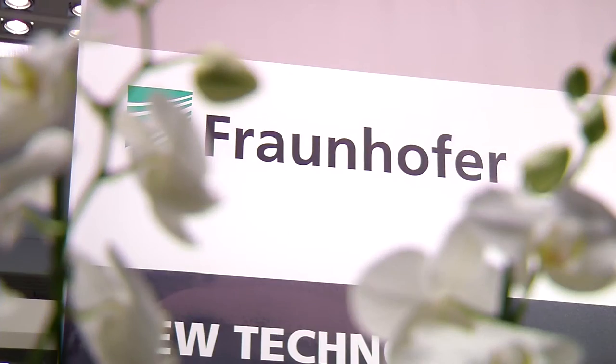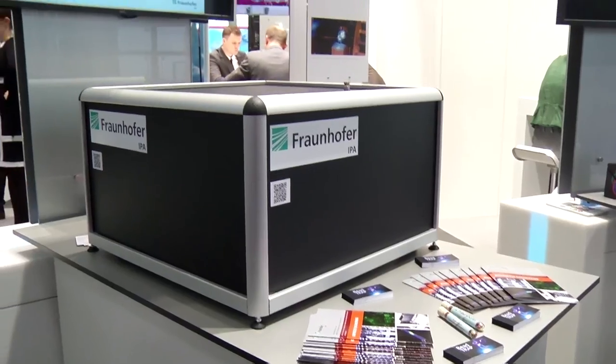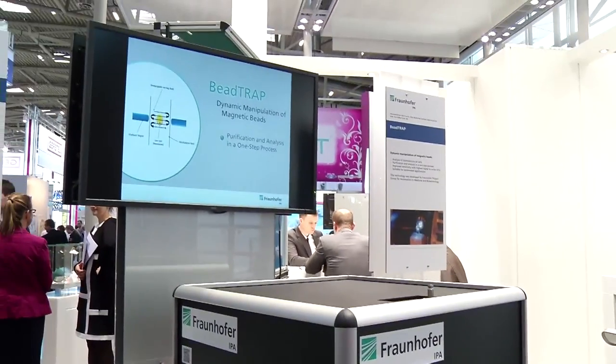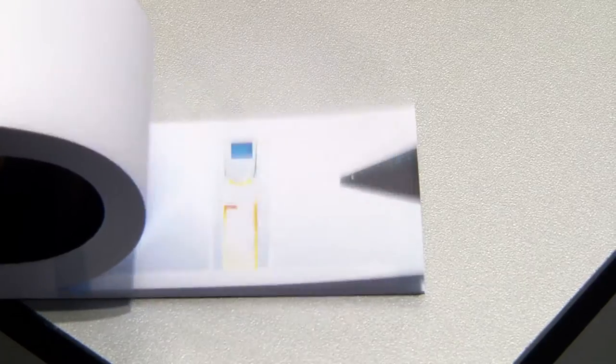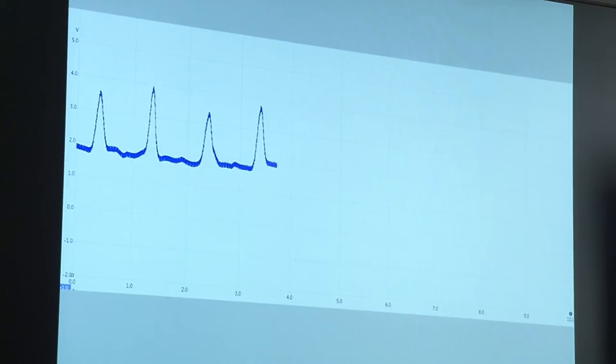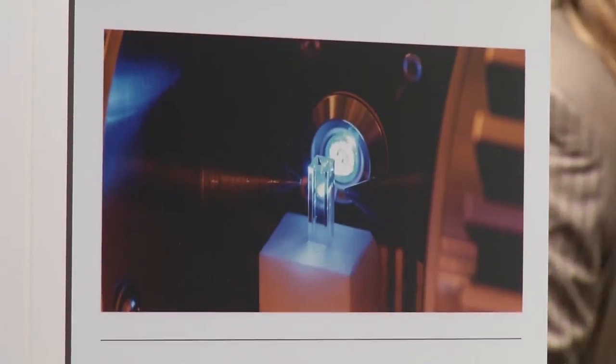The Fraunhofer Institute has developed a cancer diagnosis method giving fast confirmation of the presence of cancer proteins, so-called tumor markers. Magnetic beads given fluorescent antibodies latch on to the targeted proteins, the magnetic field pulling them to where they can be seen under light. The concentration of the light provides evidence of any presence of a tumor marker.